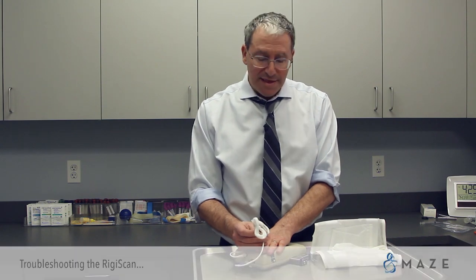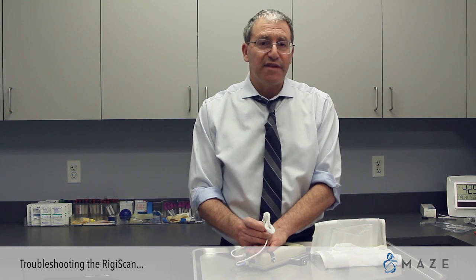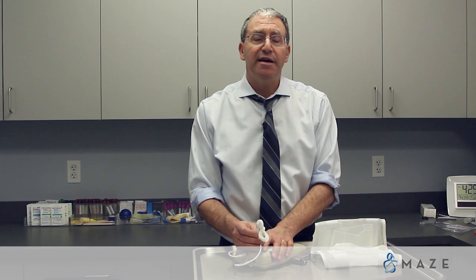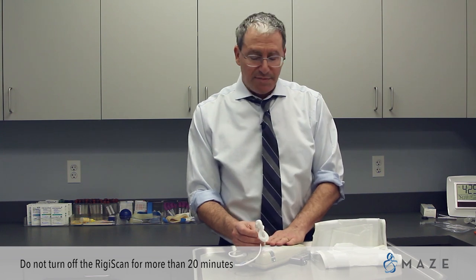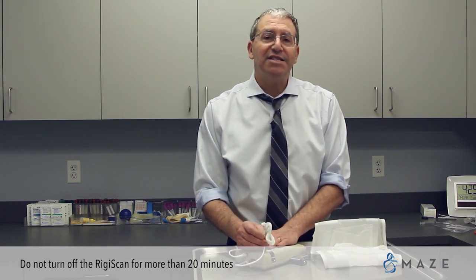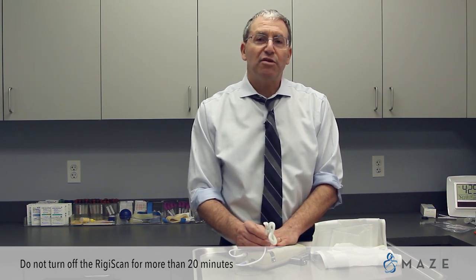Now let's talk about common things that can happen. If you need to go to the bathroom in the middle of the night, that's fine — you can actually turn off the machine. I would leave the loops on and just urinate through it. However, if you turn the machine off for more than 20 minutes, as expensive and sophisticated as it is, it thinks it's the next night, and you will actually lose the ability to do three nights.